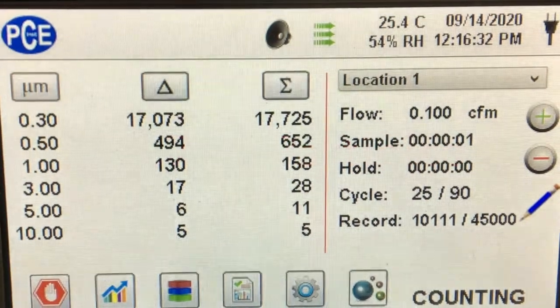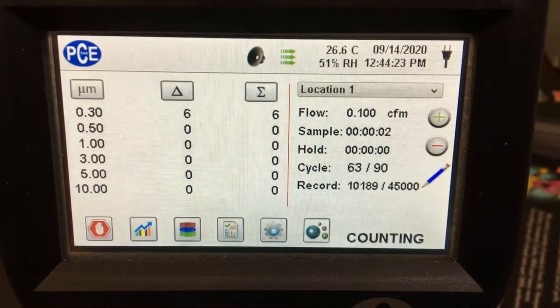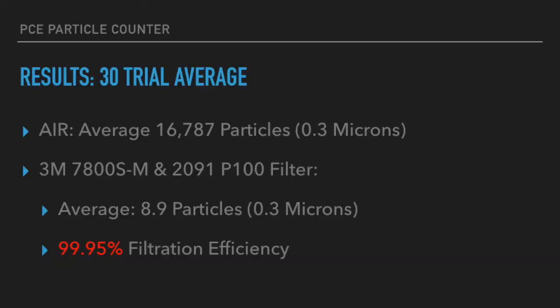Nonetheless, this mask and filter performed exceptionally. We got only 8.9 particles per liter on average over 30 cycles. If you do some simple calculations, that comes out to be a filtration efficiency of 99.95 percent.